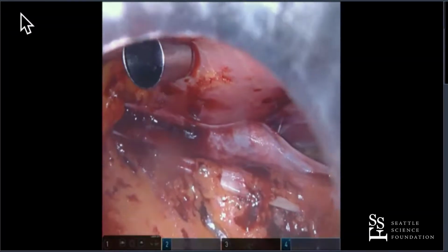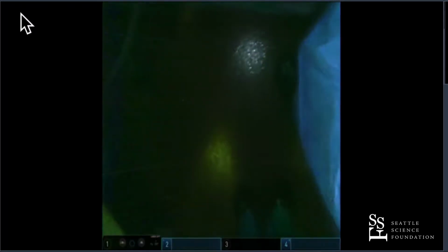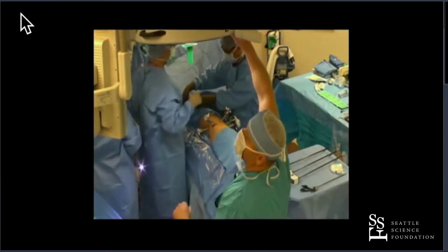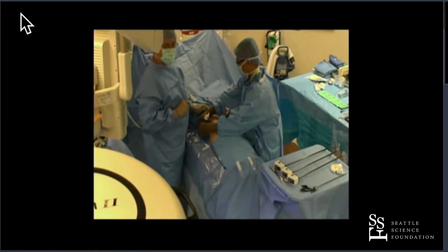So now we're going to dock and we're going to switch scopes. We're going to go to the zero scope and we're going to bring the robot in. Let's go external, Steve, and let's go with the big camera, the overhead camera, okay? We have a lot of cameras here, which is nice. We have the bedside camera, if you will, and then we have an overhead camera.